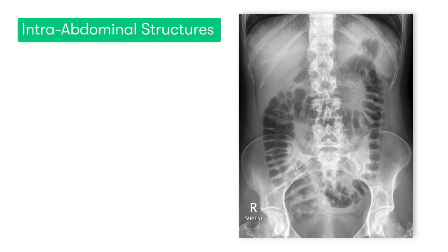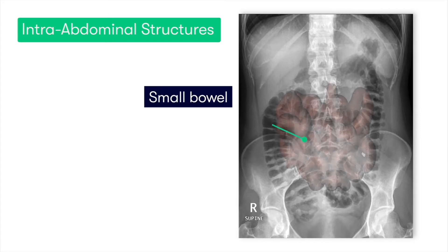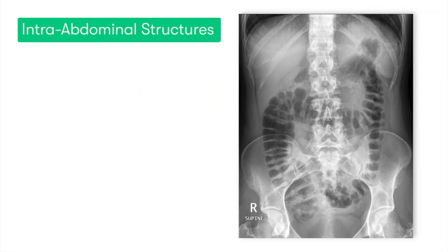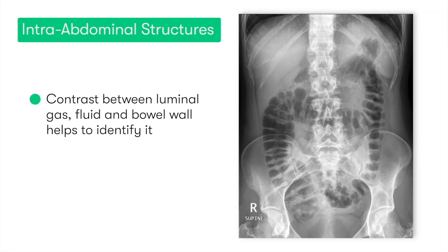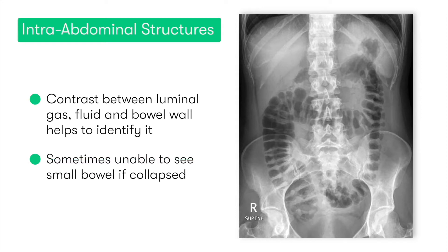Moving distally on from the stomach, we have the small bowel, which we can find lying centrally in our abdominal x-ray. Similar to the case with the stomach, we may be able to see the small bowel because of the contrast between the luminal gas, the fluid, and the wall of the bowel. However, it's not uncommon that we're actually unable to see the small bowel because the bowel is collapsed.